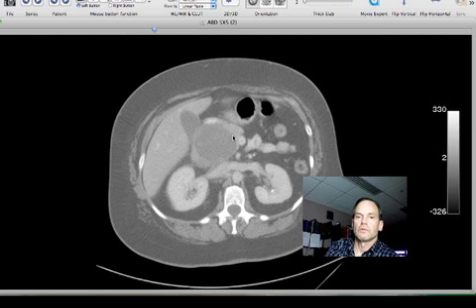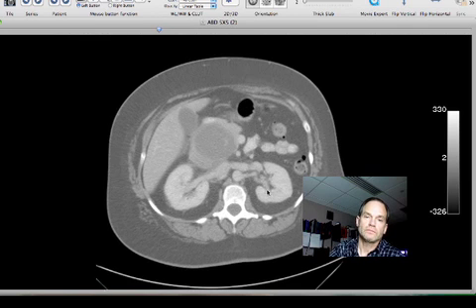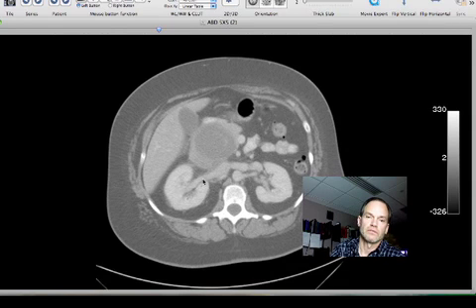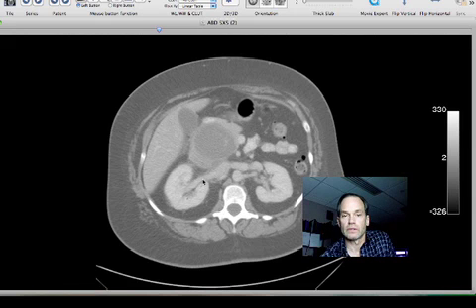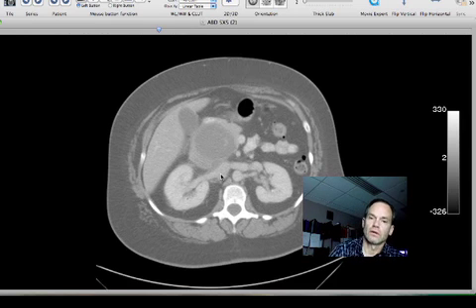Whenever we see a renal mass, we want to look carefully at the renal veins, because often a renal neoplasm will extend into a renal vein and potentially up into the IVC and farther. But here we can see the renal vein pretty well coming into the inferior vena cava. Here you can see the left renal vein and the right renal vein, and you can usually tell the renal veins partly because they're larger than the renal arteries, but the most reliable clue is that they connect with the inferior vena cava.